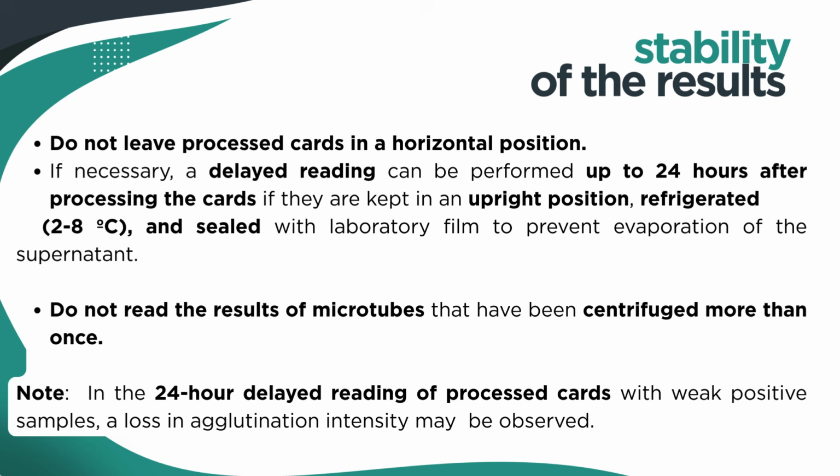This time let's discuss the stability and cost efficiency of the results obtained from using the DG gel card. Please do not leave processed cards in a horizontal position. If necessary, a delayed reading can be performed up to 24 hours after processing the cards, if they are kept in an upright position, refrigerated at 2 to 8 degrees Celsius, and sealed within laboratory film to prevent evaporation of the supernatant.